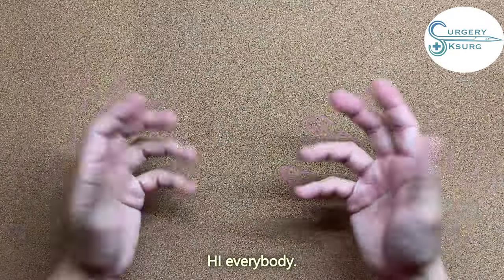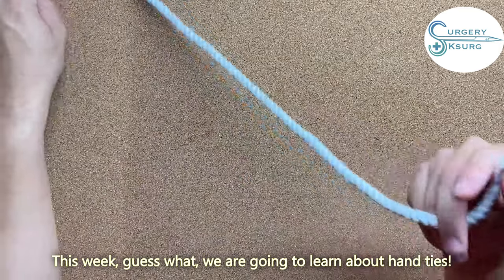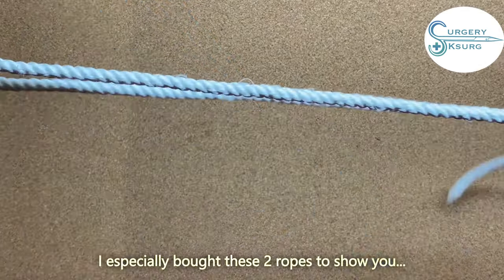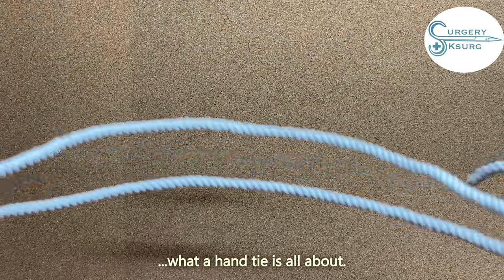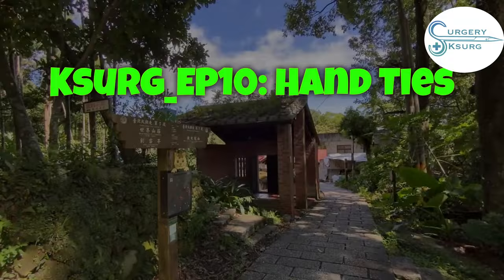Hi everybody! This week we are going to learn about hand-tie. I specially brought these two ropes to show you what a hand-tie is all about. Let's move on.